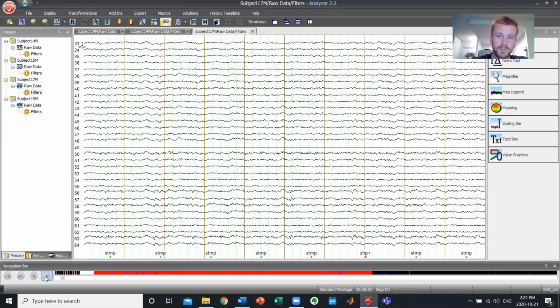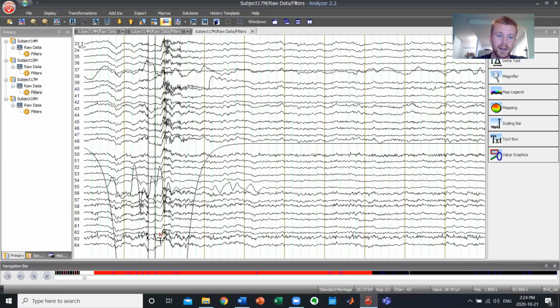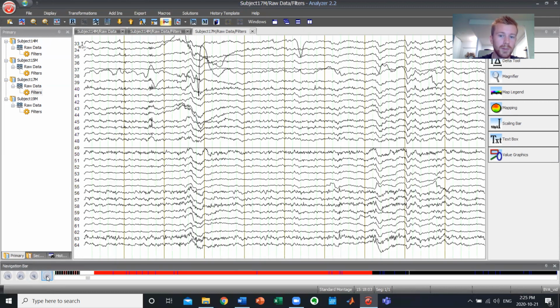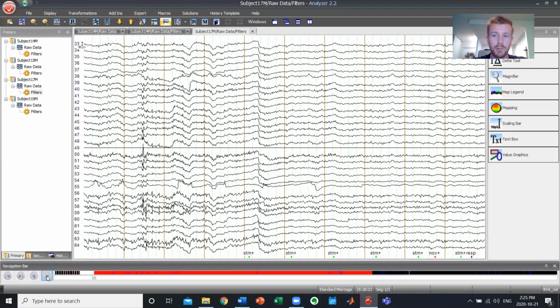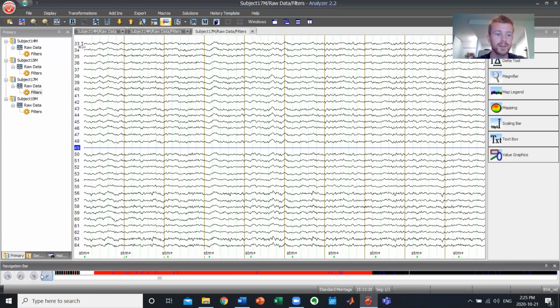Now, first off, things like this right here I wouldn't be too worried about, because as you can see, this type of noise is happening across every single channel, and it's not actually happening during a relevant part of the experiment. We don't see any markers here, so I wouldn't be too worried about that type of mess. It will get dealt with in artifact rejection. But I would be concerned right here with channel 49 that did not record for the entire experiment. So we can see all the way across, channel 49 wasn't recording, something was off with it.